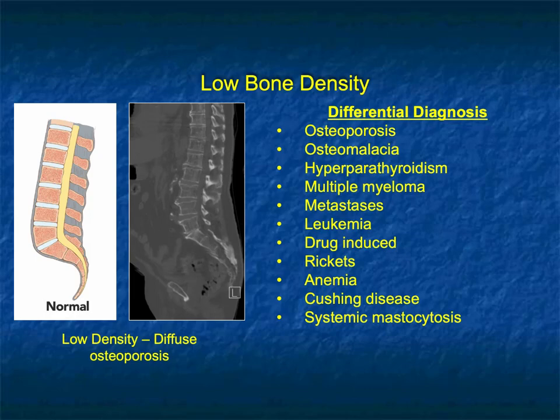Next, diffuse osteoporosis — a common finding, particularly in older patients and more common in women. When you see loss of bone, you could think of osteoporosis or osteomalacia, hyperparathyroidism, multiple myeloma which gives really washed out bone often with a destructive pattern, metastasis, infiltrating tumors like leukemia, drug-induced causes, rickets, anemia, Cushing's disease, and systemic mastocytosis. There's a very large differential diagnosis. In this case, there are some osteophytes and degenerative change, but very low bone density with vertebral bodies maintaining their height — this was diffuse osteoporosis.